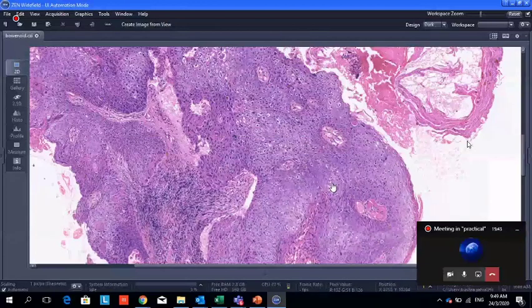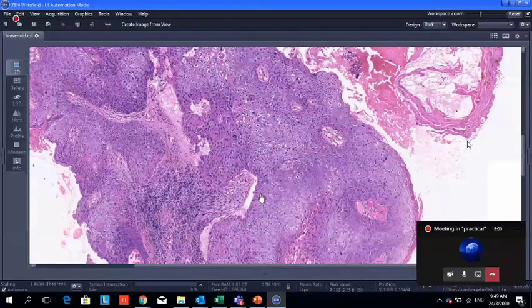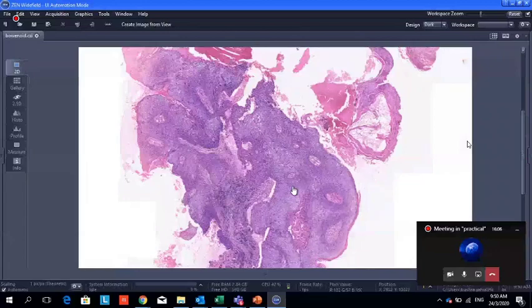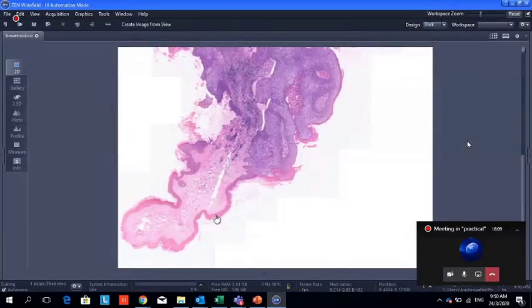Doctor, what involves the proliferation from the basal membrane to the outer part? Something that involves the whole thickness is dysplasia. Look here at the layers. It's a few layers, isn't it?